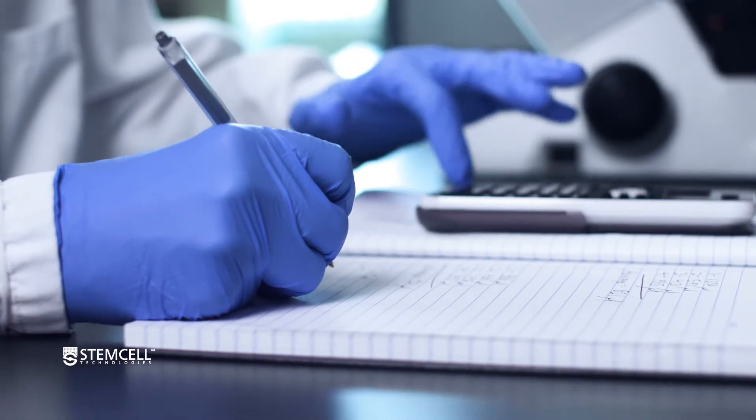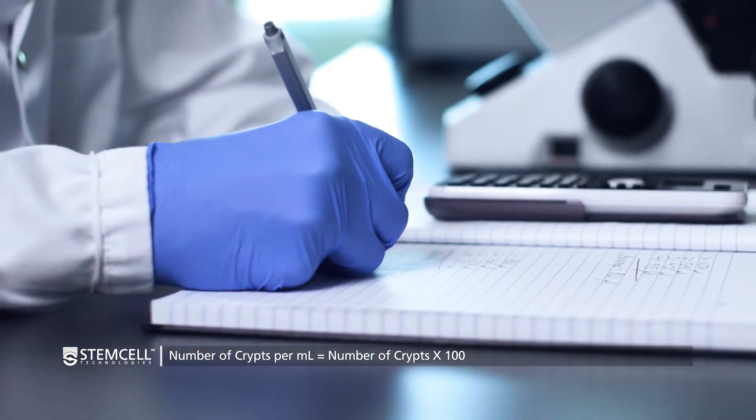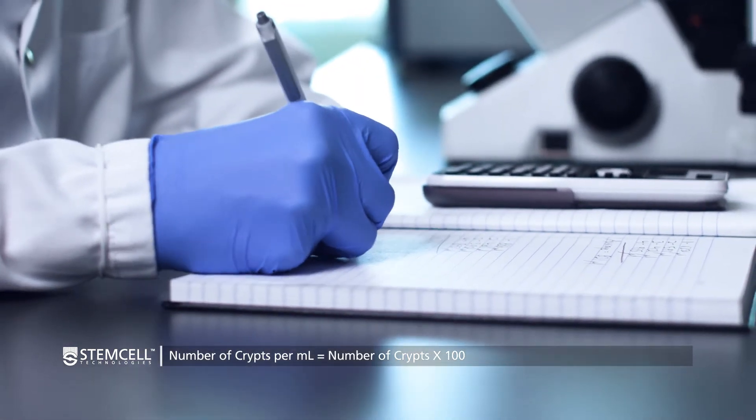To calculate the number of crypts per milliliter, multiply the number of crypts by 100.